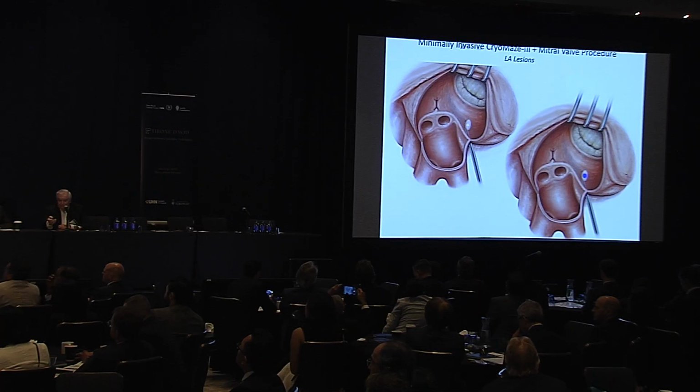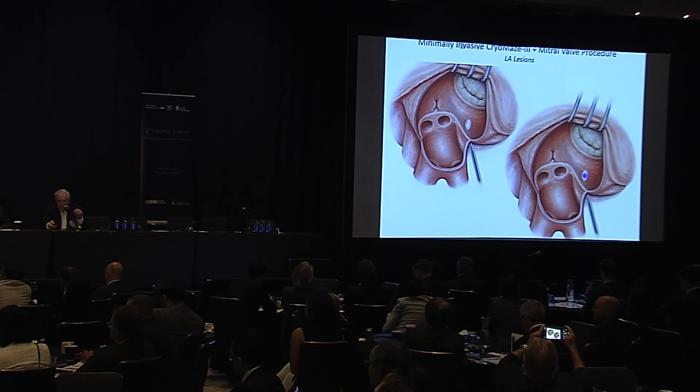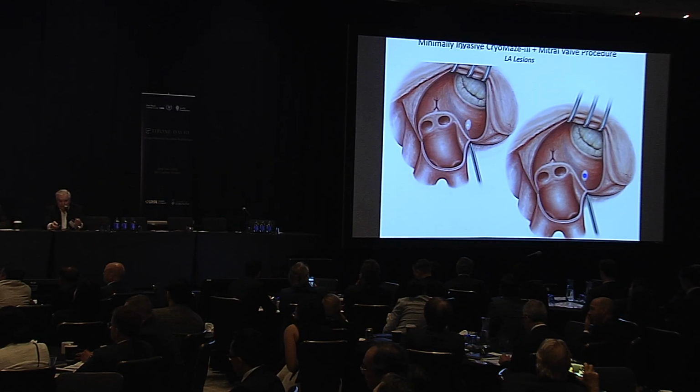You then place the cryo probe, curve it, place it behind the heart by taking some forceps down at that lower end of the left atriotomy. Pass the probe behind the heart, put it right on the coronary sinus, which you can see, and push towards yourself, pull up towards yourself. So you've got pressure to collapse that coronary sinus and turn the cryo on.